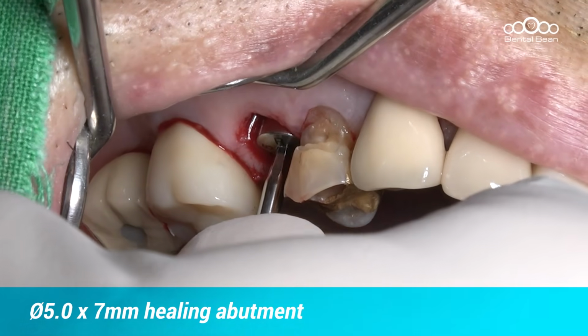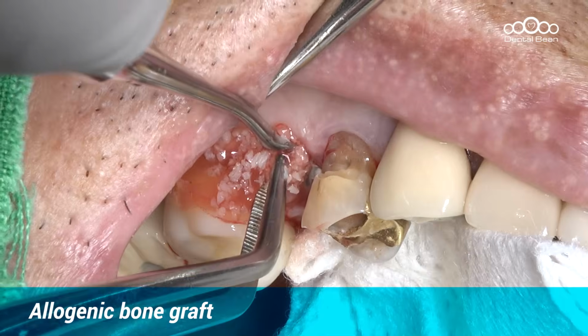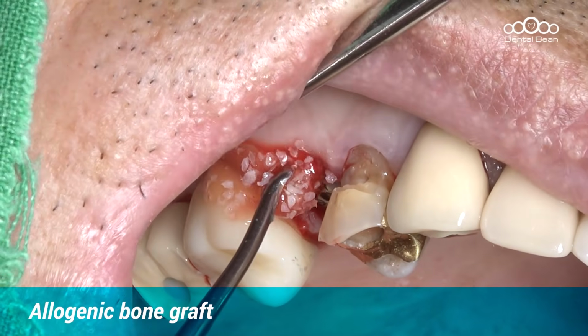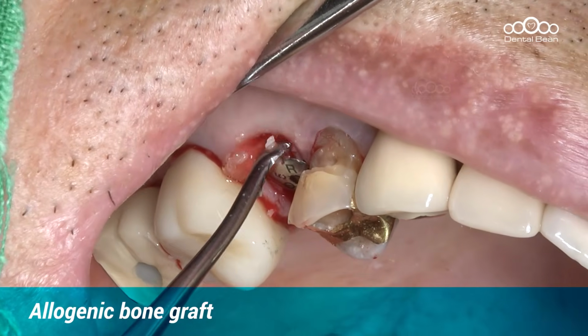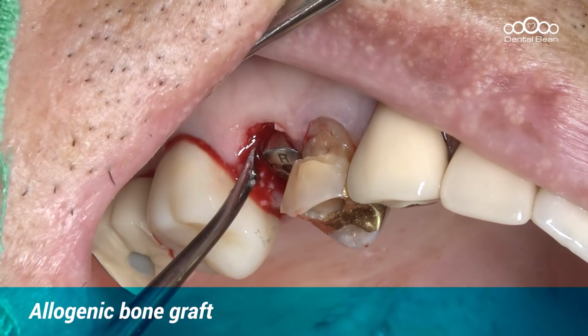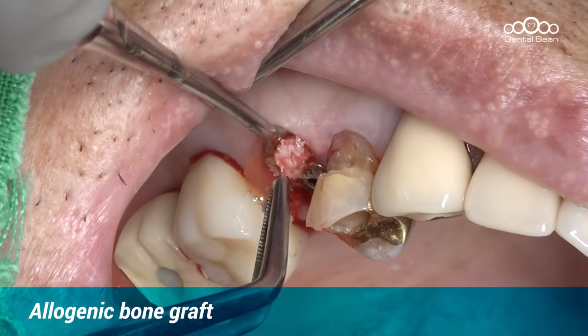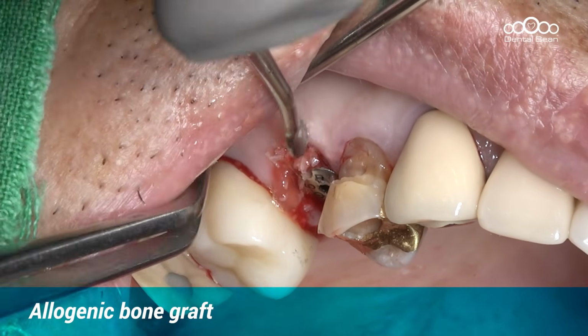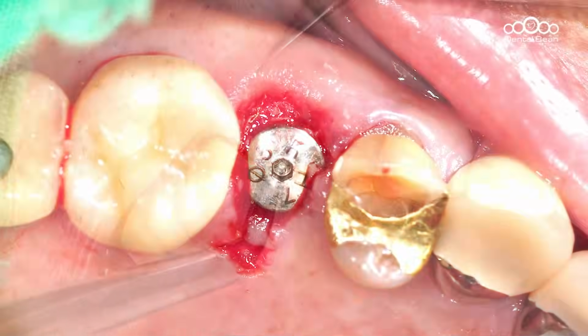After connecting the healing abutment, since the gap distance exceeded 2 millimeters, allograft bone was placed. Of course, if the implant had been placed deeper and the gap distance were smaller, bone grafting in premolar areas could sometimes be omitted. Since this case is close to a self-containing defect, only allograft bone was packed into the site.